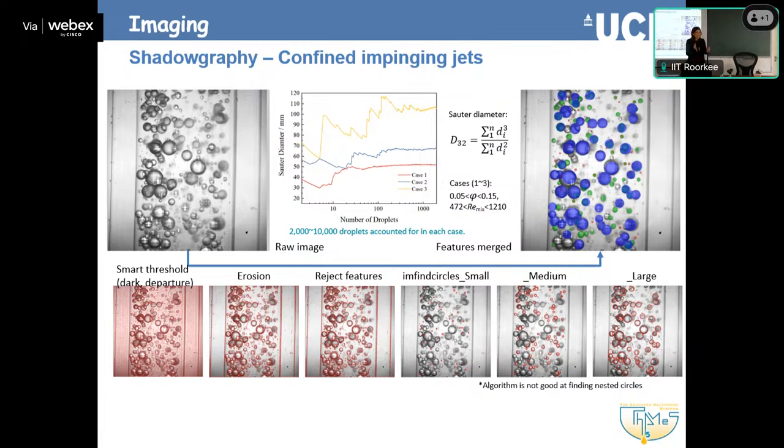And these are not as clear now. But what I wanted to show you here is that you can do some post-processing to actually get information even from these images. Again, here the maximum we could go was about 10%. Then the images were not easy to see. Okay, so we have all these images, and then this was done in MATLAB actually, and we have published and worked on this. I think I have the reference in a subsequent slide.